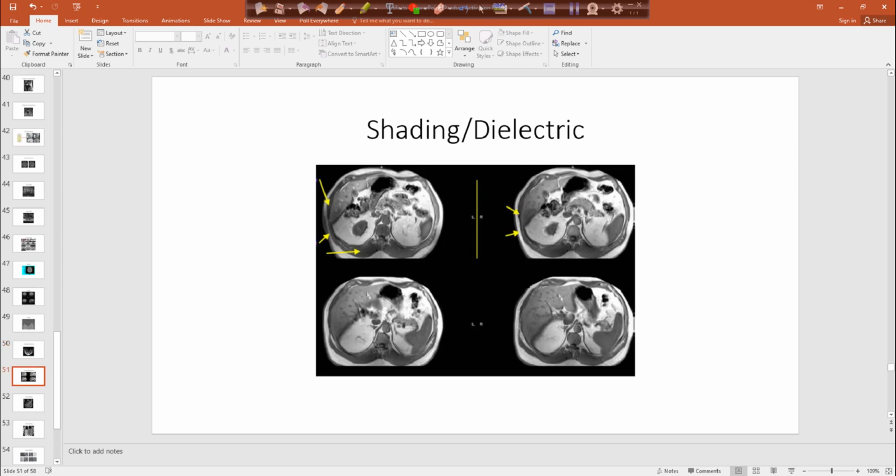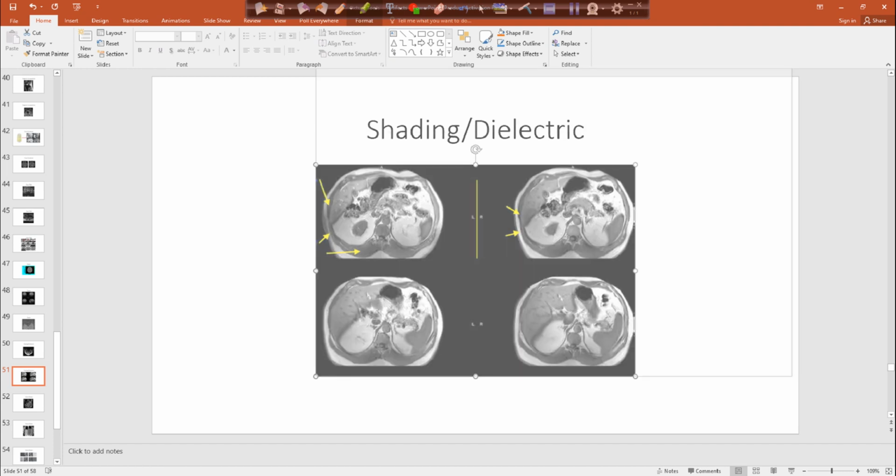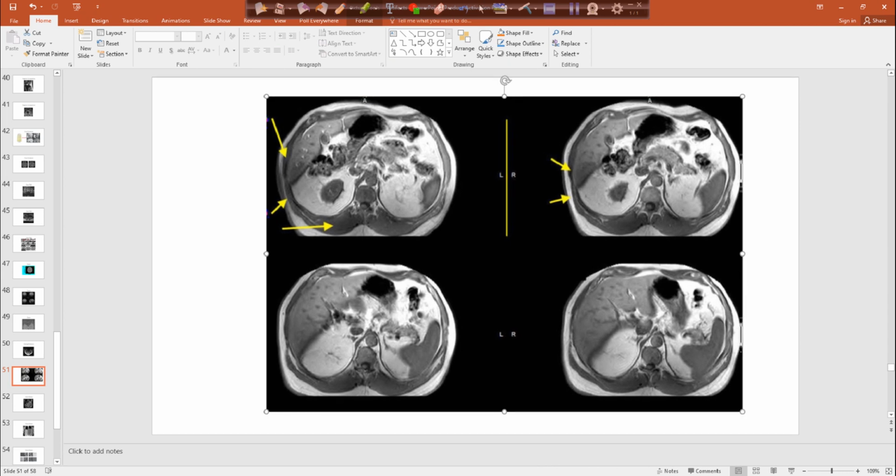But here, if you can really see, let's zoom in a little bit. See how the right side of this patient right here, you have those erector spinae muscles back here. See how the right side is darker than the left side? See that? So the coil was probably loaded, that flex coil was probably somehow touching this side, and then it floated up on that side.